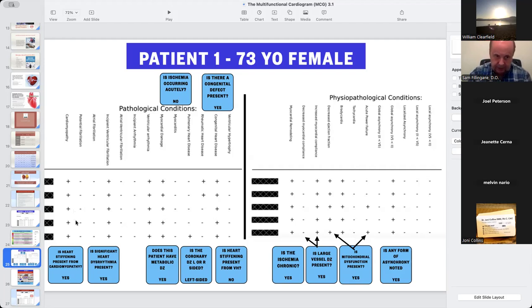The next thing we want to look at is, does the patient have heart stiffening? And I've already told you about the cardiomyopathy. There's a 5 out of 5 positive change under that side of heart stiffening. On the opposite end, you see ventricular hypertrophy, and it's 5 out of 5 negative. There's 11 disease states that can create a cardiomyopathy shift in a patient's heart stiffening. The primary one that contributes to ventricular hypertrophy is diabetes. And as the diabetes advances, hypertension further aggravates ventricular hypertrophy.